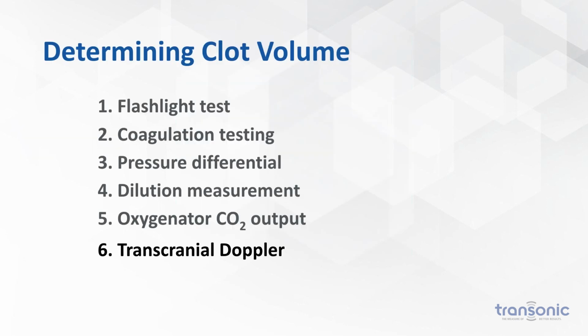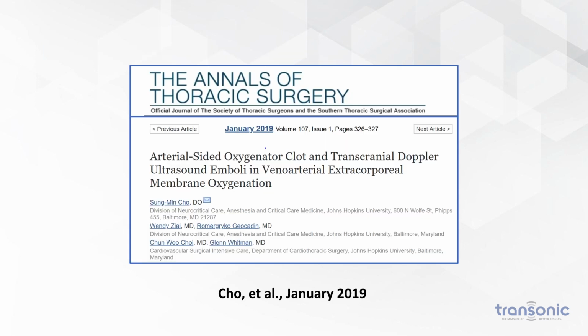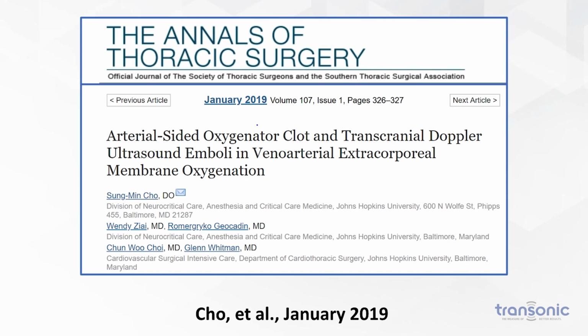The 6th one we want to look at is a transcranial Doppler. There's a very gifted doctor that was at Cleveland Clinic, and he's been at Johns Hopkins for 2 years, Dr. Cho, who's been taking a look at the results of microembolic signals as they flow through the middle cerebral artery while patients are getting valves done, VADs, ventricular assist devices, and now he's taking a look at ECMO.